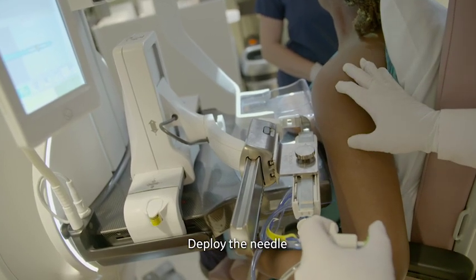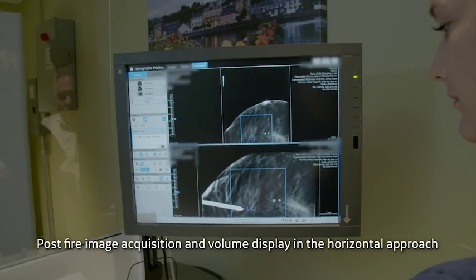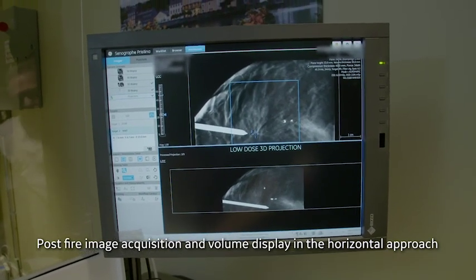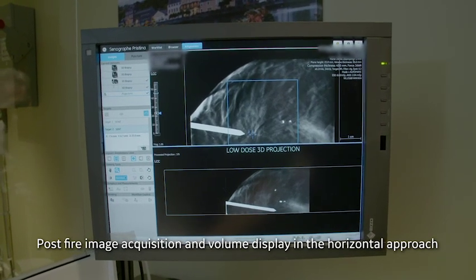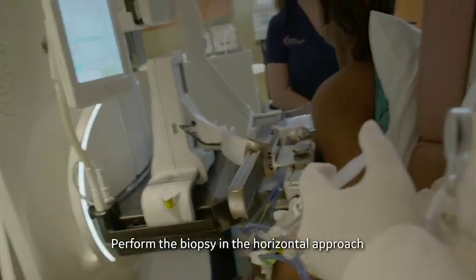The radiologist deploys the device, and a set of post-fire acquisitions are performed. Images are displayed immediately, and the software allows the radiologist an easy pre-fire and post-fire display to confirm that the needle has entered the area of concern.